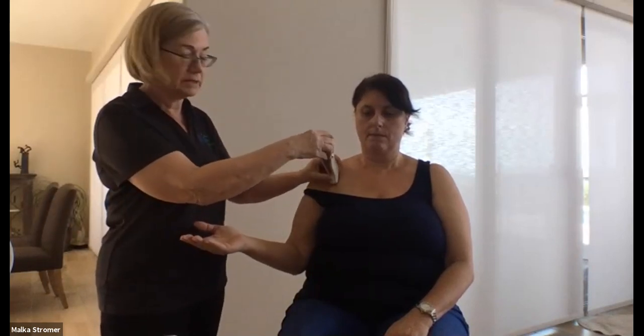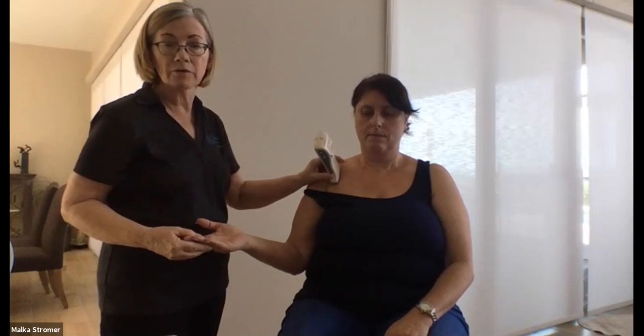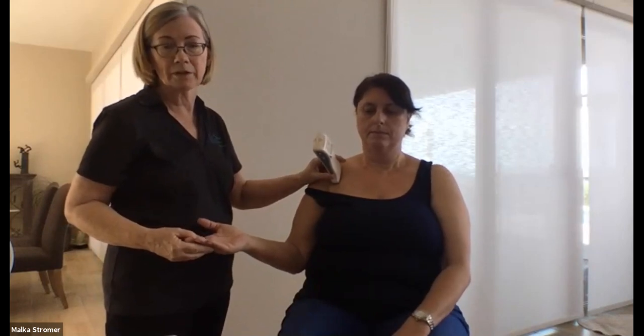Once she's in external rotation, we'll rotate 90 degrees and get a view of the short axis of the subscapularis. Okay, so third position, do you have any money? I don't know. Let me check. So I'll have her go into her back pocket.